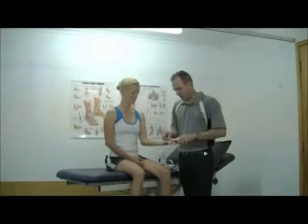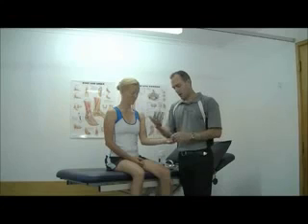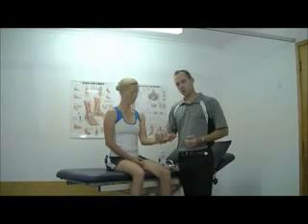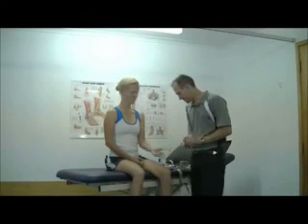With a little bit of stretch. Now that will provide some mechanical assistance in outer range, but once we come in, the tension in the elasticity is gone and it's no longer providing the same elastic support as what we can achieve with the dynamic tape. Again, I must emphasise that this wasn't the major aim of using a kinesio tape.